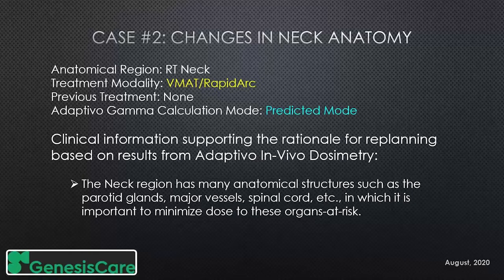But in our facility, our policy is to run gammas on every patient in the background automatically. It doesn't take any effort by the physicist. And we're still notified and we still respond accordingly. But if the doctor did not request it in his prescription, the reports do not go into the patient's record. So that's one of the big differences here.